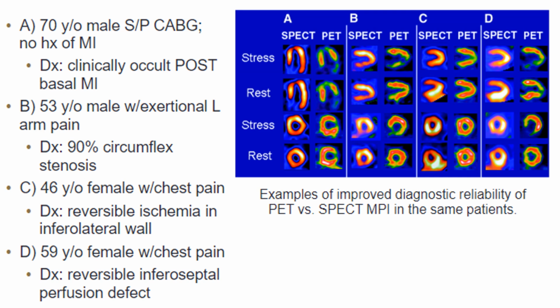And so if you're looking for whether or not there is viable tissue, it is better to get the PET MPI study with it so that you get a much more accurate comparison. Now, one of the reasons that the PET images just have a lot better image quality is just the overall physics of PET imaging and how we're getting the two 511 keVs, the coincidence imaging.